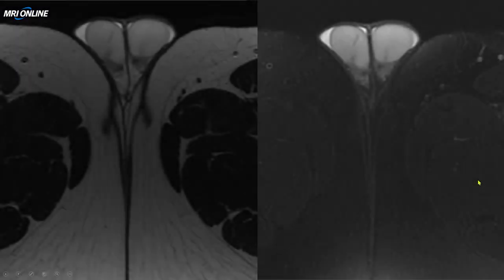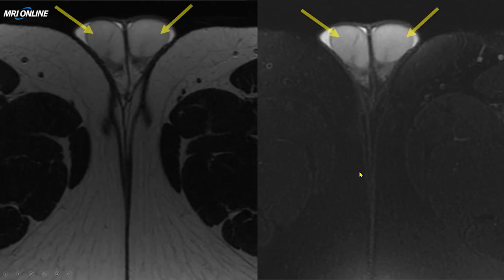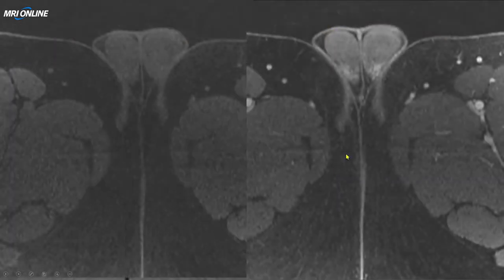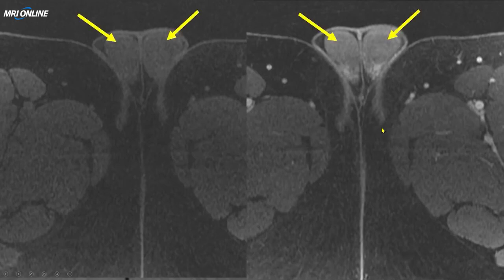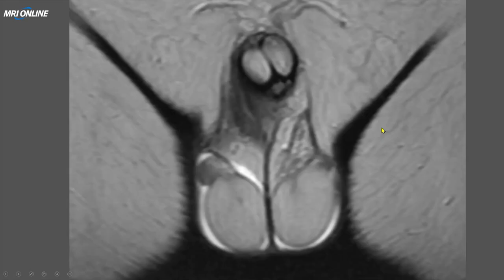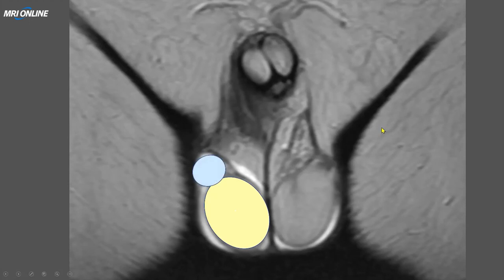Here we have a scrotal MR. These are T2-weighted images — the first one without fat saturation, the second with fat saturation. The testes are very homogeneous, intermediate signal, and we can see just a little bit of fluid around them. With T1-weighted images, without contrast and with contrast, the testes are homogeneous soft tissue intensity, and there is enhancement of the testis and the epididymis. We see the testis in the scrotal sac, the epididymis sitting above it with its head, the spermatic cord with its vessels, and usually a little crescent of fluid can be seen.